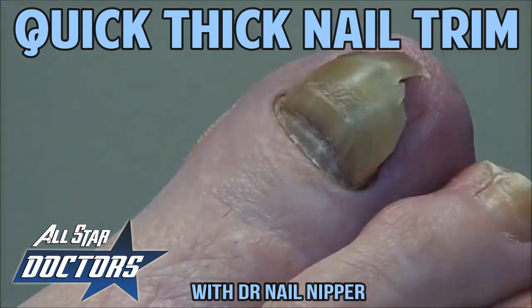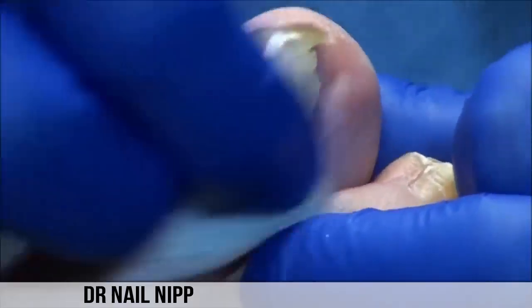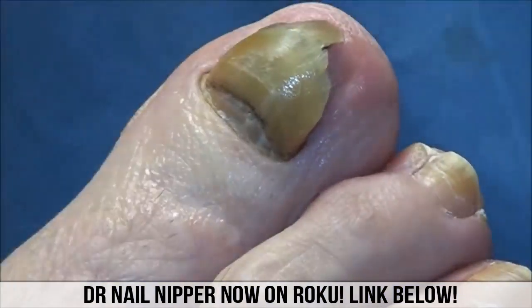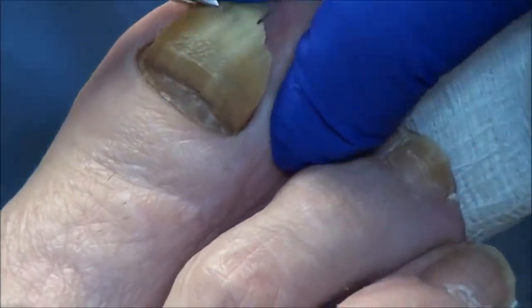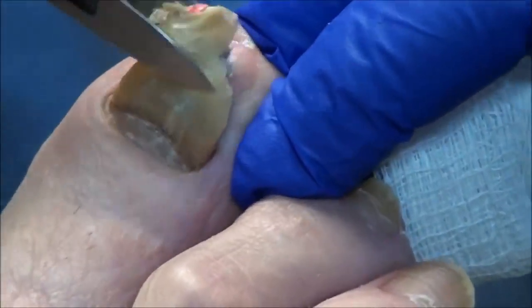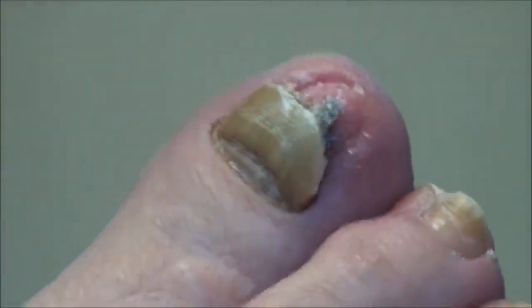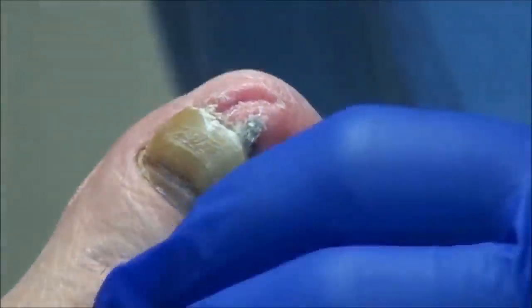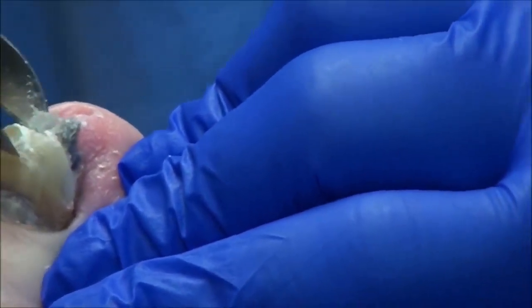So let's go ahead and we'll just trim this, and my sense is that it's probably just going to come right off in chunks. Okay. Without any pain. If anything hurts, you let me know. Okay. Ooh, sorry. That hit the window. Dent in the wall. It's pretty thick. Yeah, but it's mostly not attached. Yeah. So.